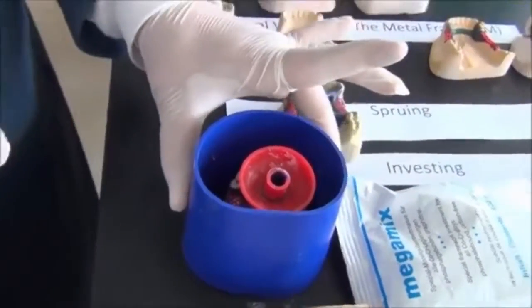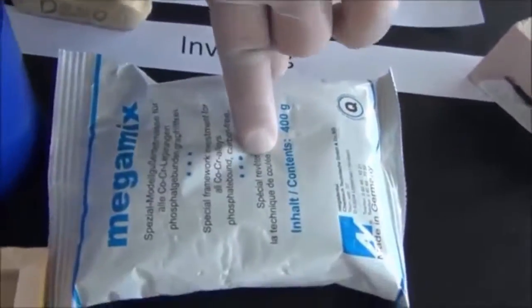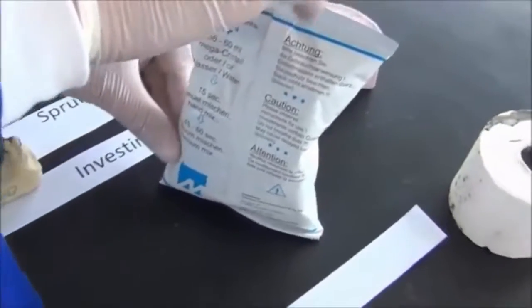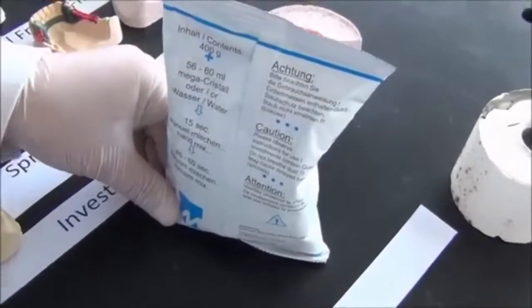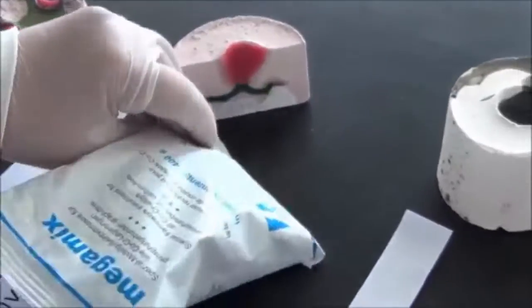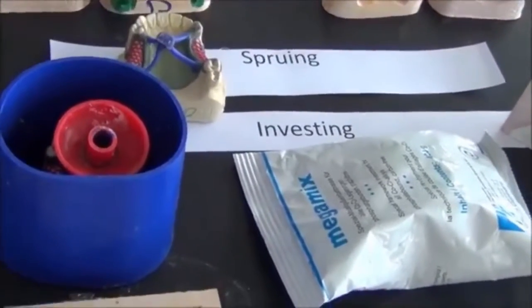Inside this investment ring, I am going to do another pour, but this time I'm going to use investment material. This is the powder, and it could have a special liquid to it or water, depending on the manufacturer instructions. These are mixed, and once we have the wet mix ready, we pour it around the material.